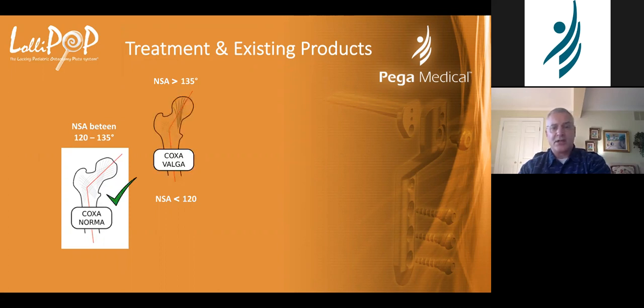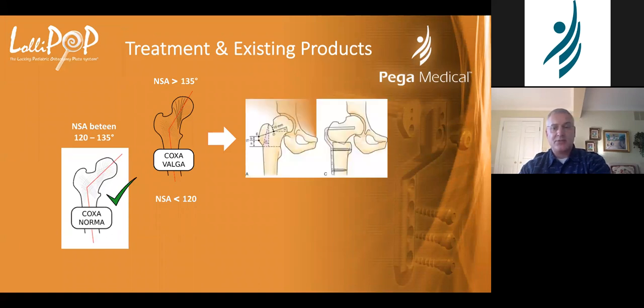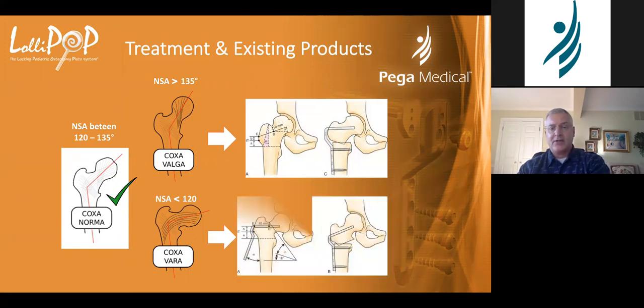We deal with coxa valgas. We deal with coxa varas. Now, sometimes we actually want to create a mild coxa vara or a coxa valga. I have a young boy with a modified Dunn osteotomy who's walked on it, and he's now got a non-union and the head's falling back off. So I want to tilt this thing up into a high valgus angle to get it to heal. And that's what this blade plate will let you do.